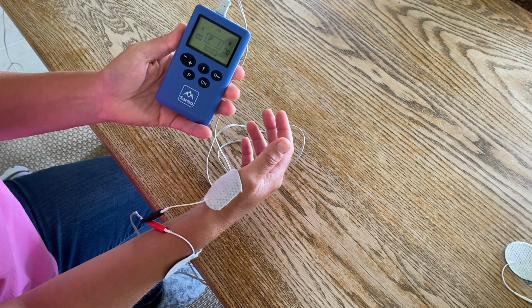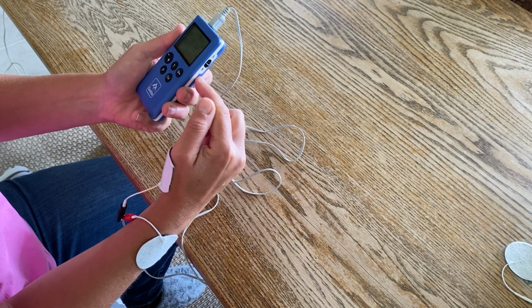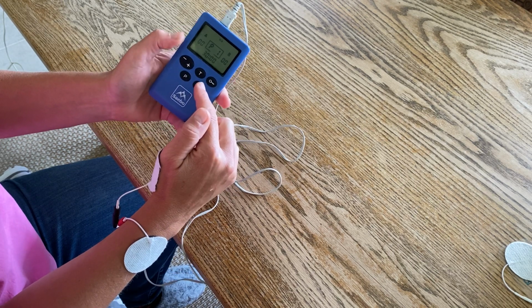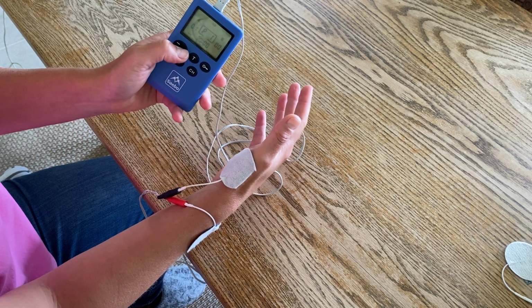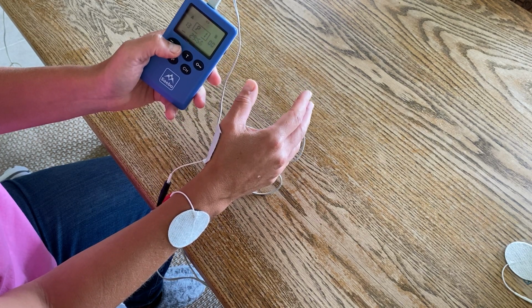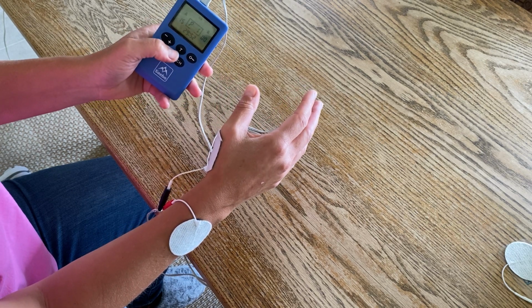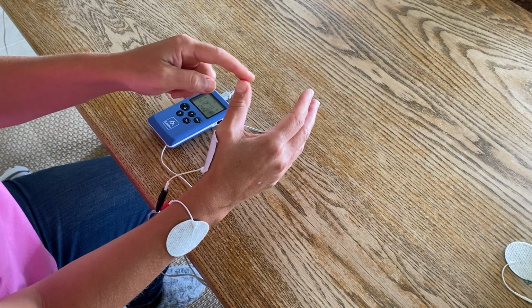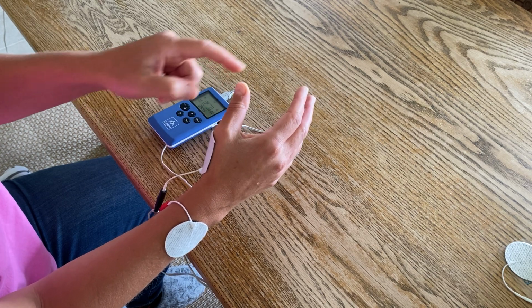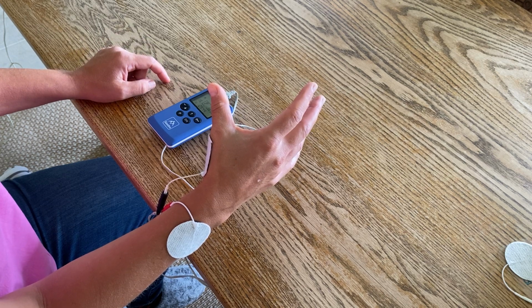So I've got our SaeboStim Pro, and I've got it on program 1, which is for upper limb strengthening. I've already turned it on. So I'm just going to turn the stimulation up. Okay, so I'm happy with that. I don't want to pull it out too much and force this, but you can see it's stretching the thumb away from, that's the stimulation there for my index finger.